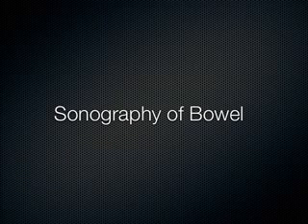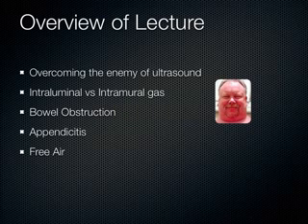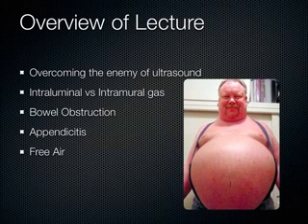Now, you talk about ultrasound of the bowel. Well, first, right off the bat, I know that you know who the enemy of ultrasound is, right? Who's the enemy of ultrasound? Air, bowel gas, generally speaking. And so that's the problem. In some patients, it's pretty significant how much bowel gas they can have, right? So that's why we have to somehow overcome that enemy.